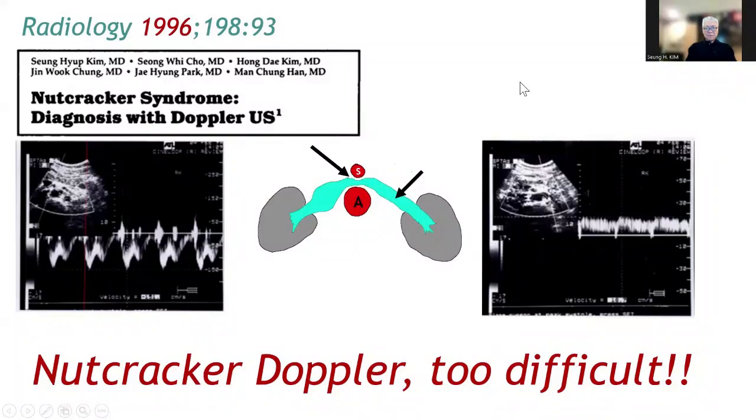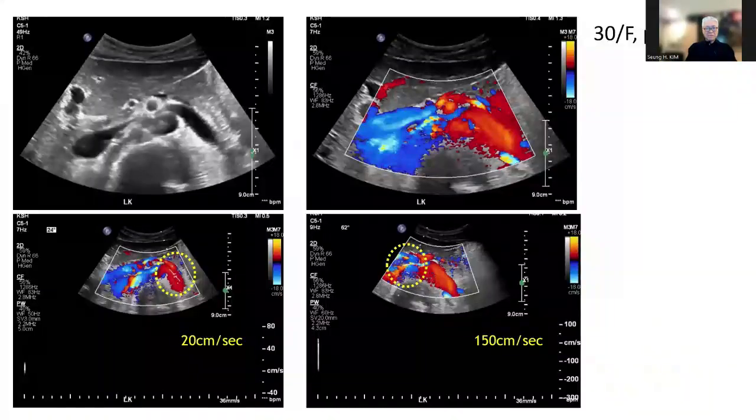But after I published this paper, I heard a lot of things from the people who read this paper and tried to do Doppler ultrasound in Nutcracker diagnosis, and many of them said it's too difficult to do. So I thought about why it was so difficult for them.